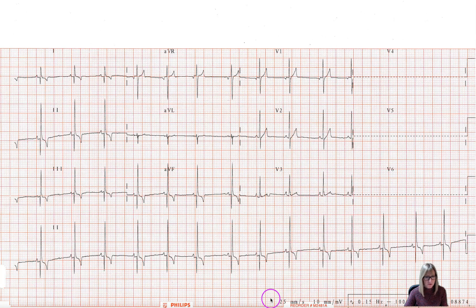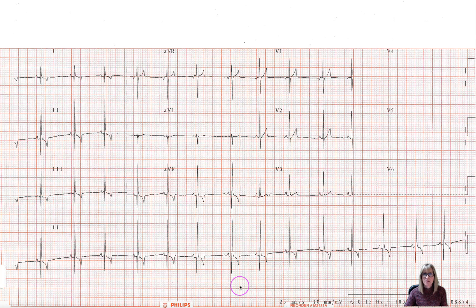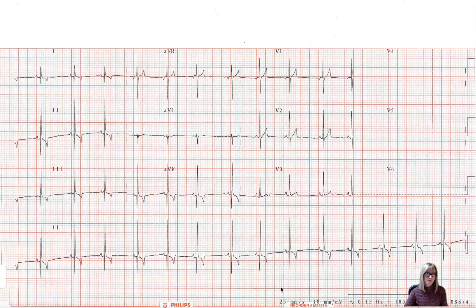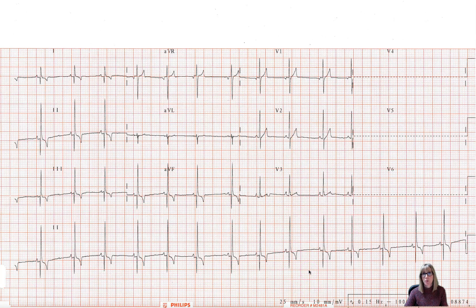If we look down here at the bottom we see the scale for our ECG: the horizontal axis is set at 25 millimeters per second. Since this is metric grid paper, each one of these tiny little red boxes is one millimeter, so we know that 25 of those little millimeter boxes across represents one second. For the vertical axis we can see here that it's set at 10 millimeters per millivolt, so 10 millimeters high represents one millivolt in terms of amplitude of voltage.